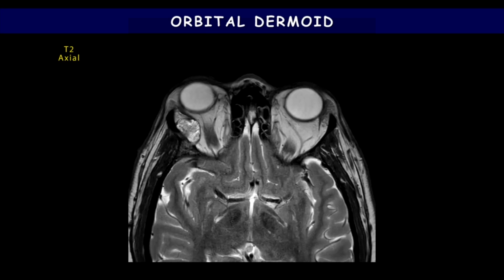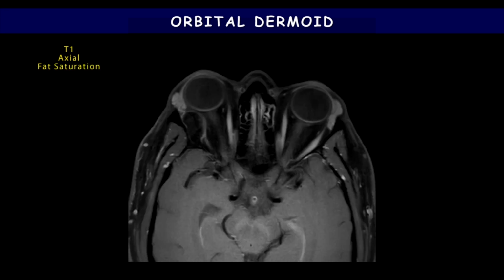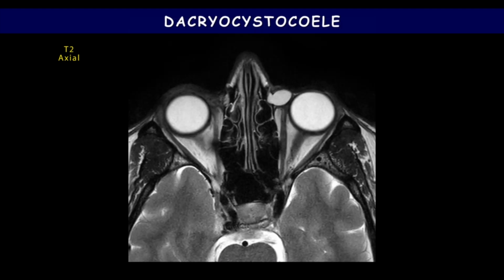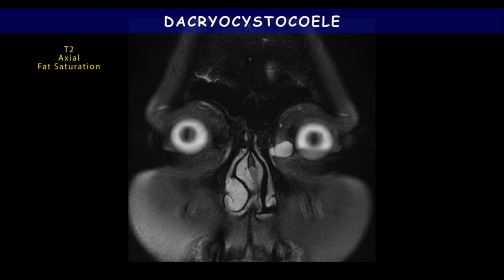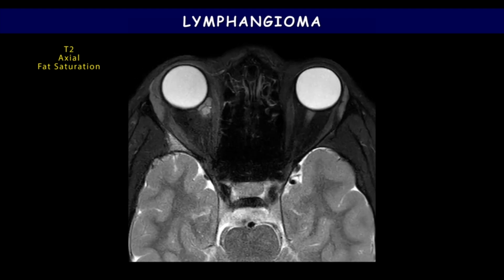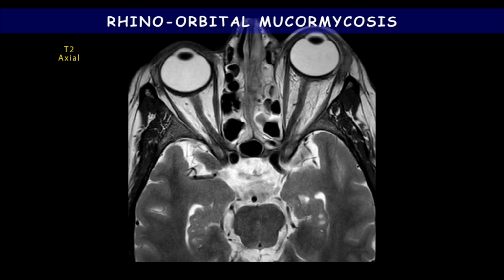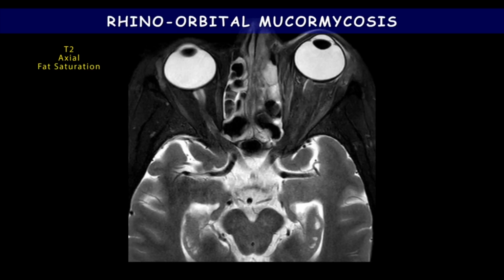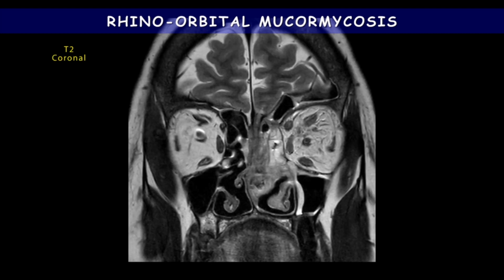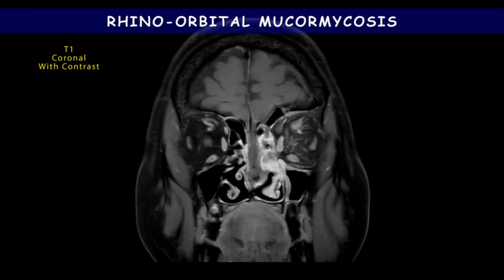Recent developments in technology, including orbital surface coils, fat suppression techniques, fast gradient echo pulse sequences, and MR contrast agents, have provided spatial and contrast resolution with direct multiplanar imaging, enabling us to study the lesions and surrounding structures extensively. MRI provides ophthalmologists with qualitative and quantitative information of various pathologies. Evolution is the secret for the next step, and a comprehensive understanding of MRI analysis makes the ophthalmologists independent and aids in clinico-radiological correlation preoperatively and intraoperatively.